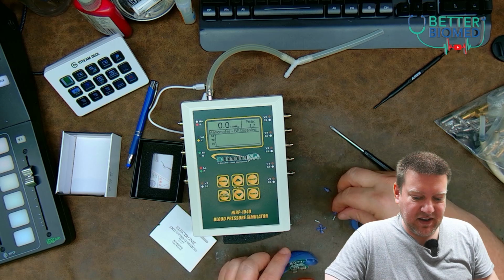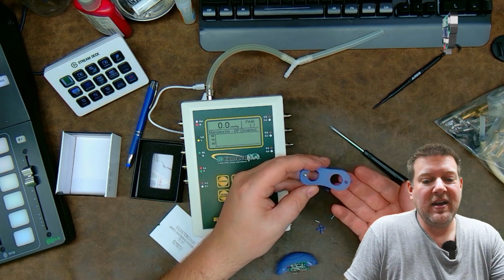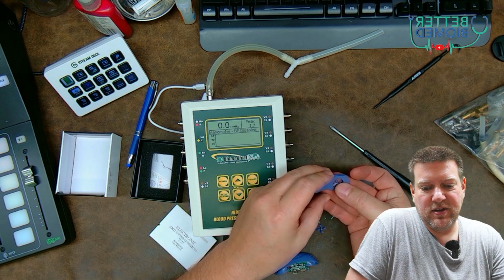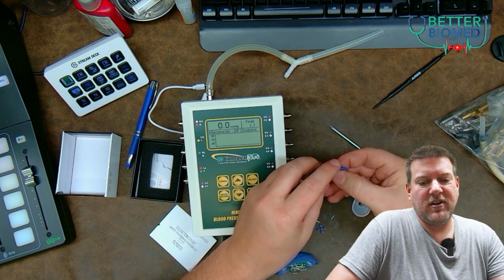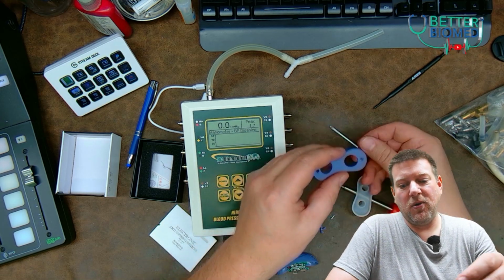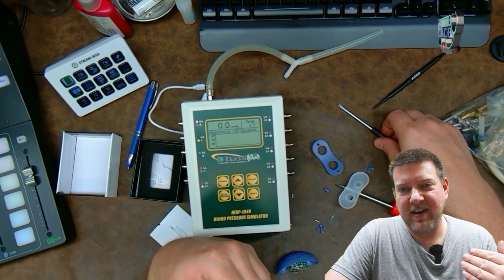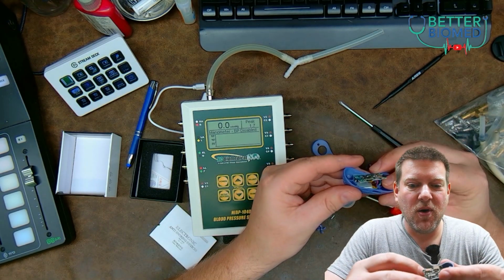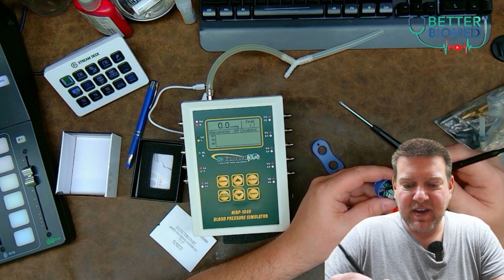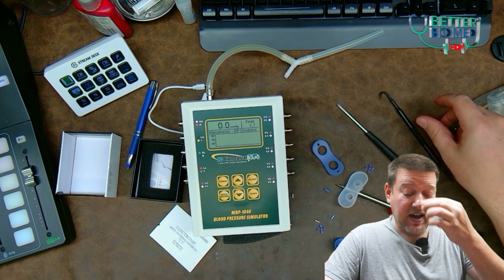So these tiny little propellers right here, first off, the diameter, they spin, yes, but they're not even the correct diameter for the housing, you know? You have to have as close to clearance as possible in order to maintain static pressure. And as I said earlier, the whole thing behind a CPAP is that it maintains a static pressure in your airway, okay? So this guy here, there's no way it has even 0.1 of a millimeter of mercury of static pressure. It is an absolute scam product. They know it doesn't work because it was not designed to work.